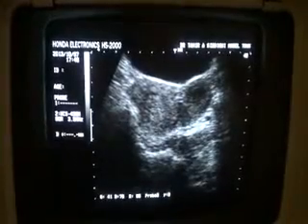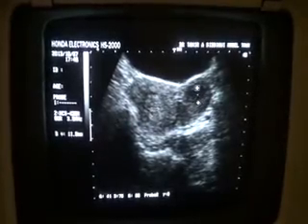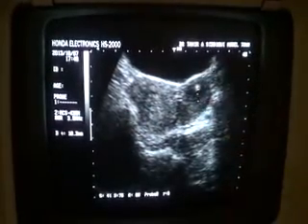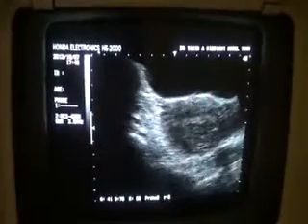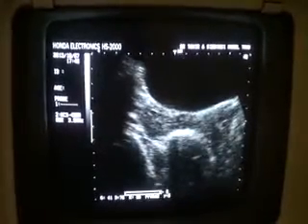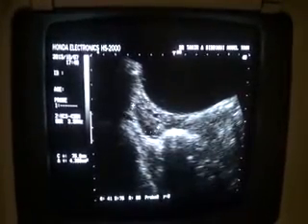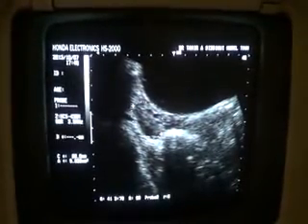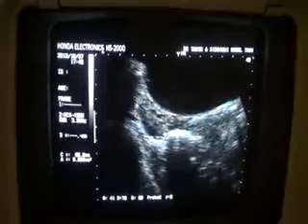This is the left ovary and we can see a developing follicle measuring 10.2 millimeters. And this is the right ovary, where you can see multiple developing follicles within it — follicles in different phases of development.